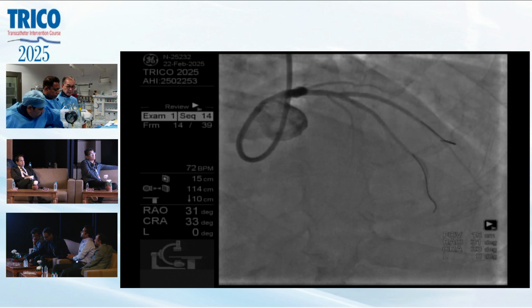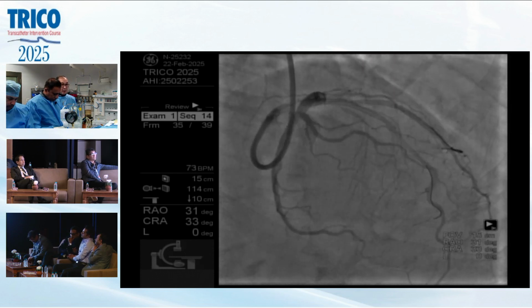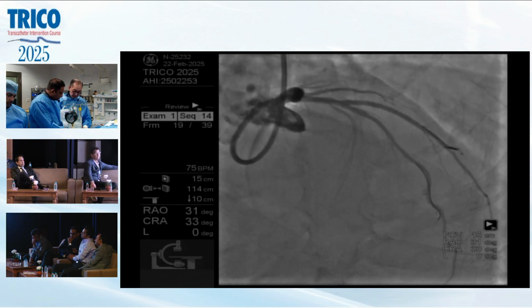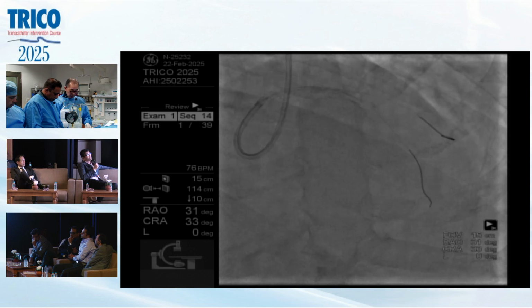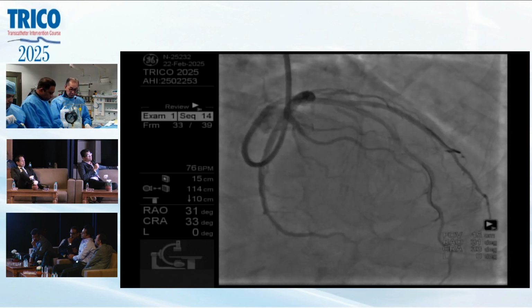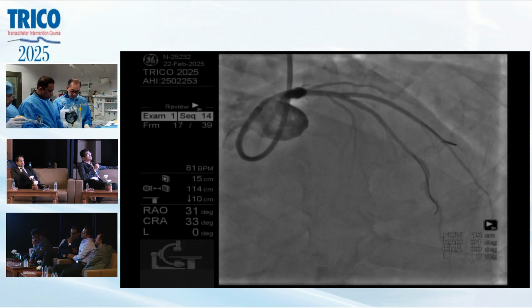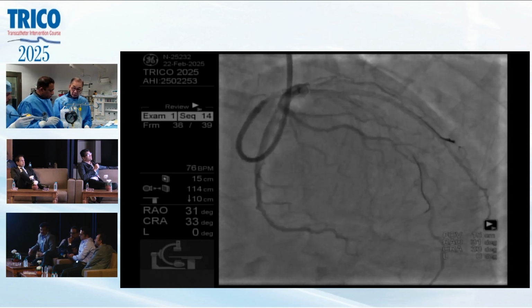Yeah, I think this is a good point. But sometimes really it's not 100% safe. In some patients, I will take the wire out. In a patient with very severe calcified disease, in the proximal LAD for example, and you jail a long length.